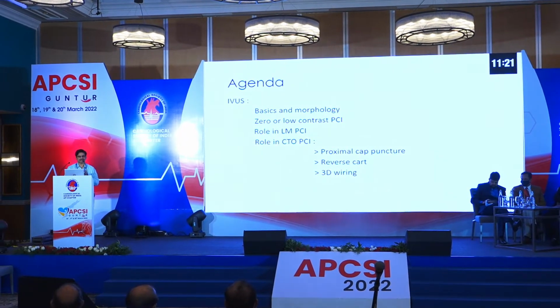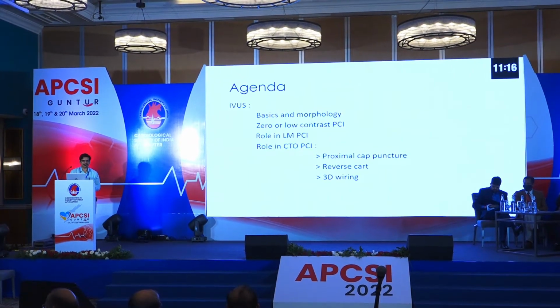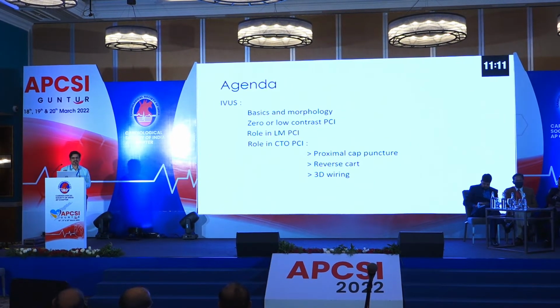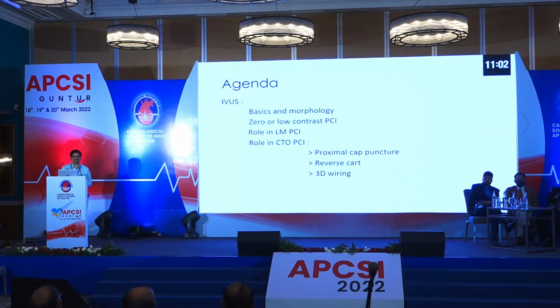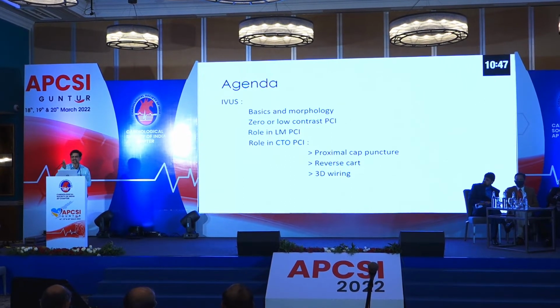Of course, in this situation, even though IVUS does better, sometimes with saline contrast OCT is nowadays feasible, but it is not universal. As we know, isoosmolar contrast will displace the blood and give the correct resolution. Water can't displace it, but still it is feasible. Some studies are being done from Ahmedabad, I forgot the operator's name, and he did almost 100 cases, and it is feasible in only 60 to 70% of cases.